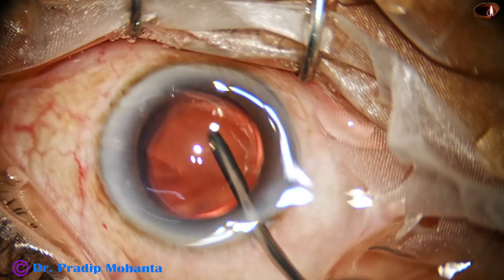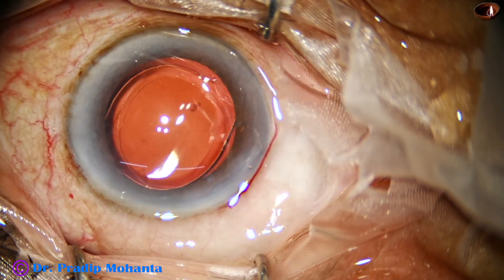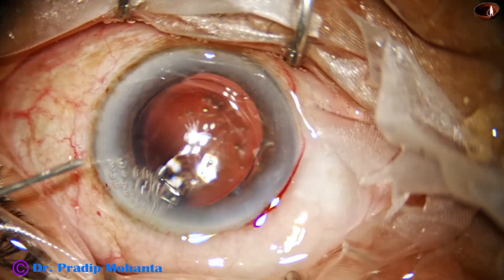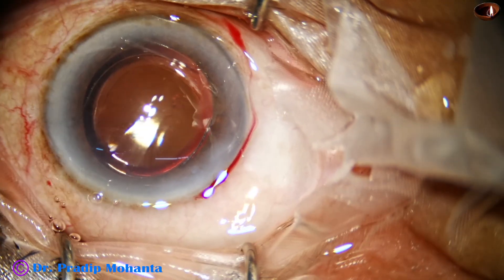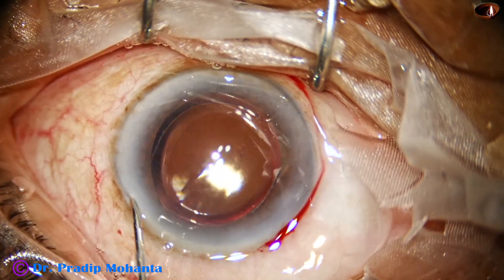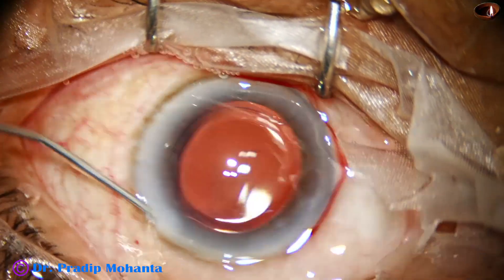The posterior capsule is polished, and it is done. This is a little bit of moxifloxacin. The side port is closed. You can just do a little bit of hydration.